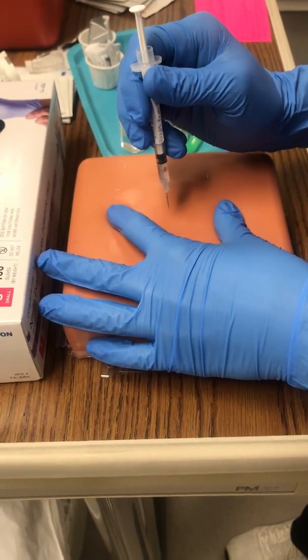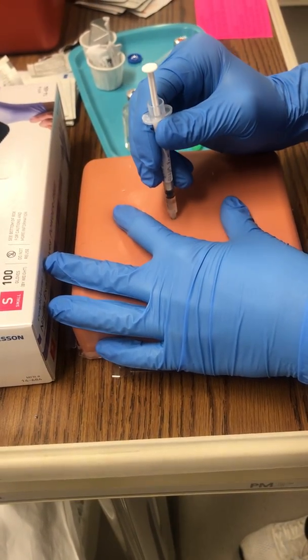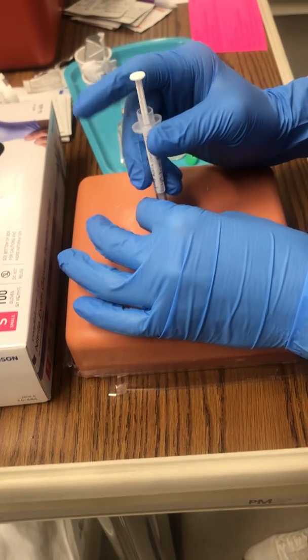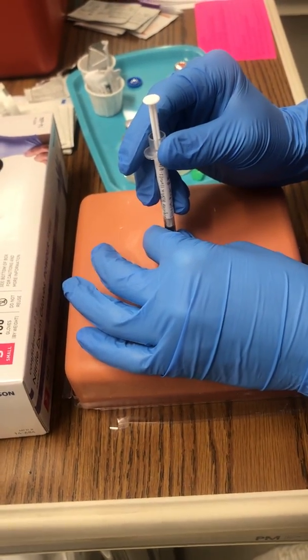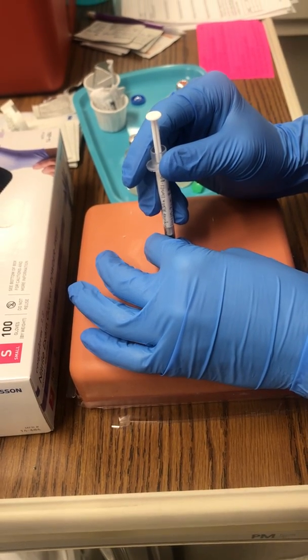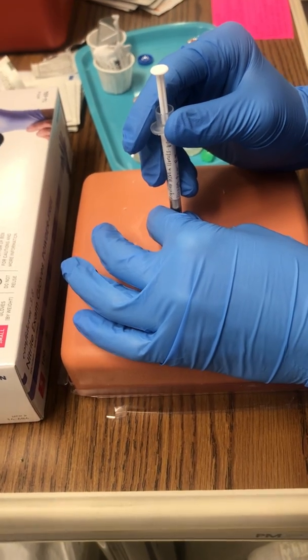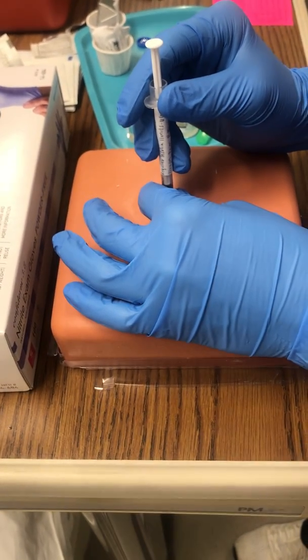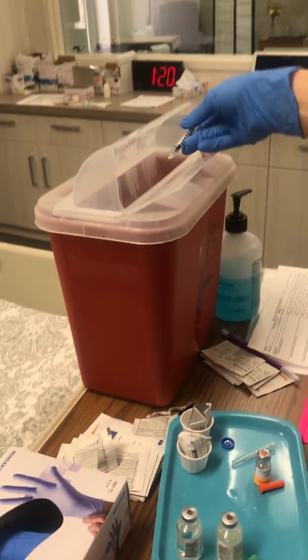So we're gonna stabilize the skin. We're gonna go in, like I said, because they have enough skin at a 90-degree angle. We're gonna stabilize, and then we're just gonna push it in slowly, and then we're gonna hold for 10 seconds. 1, 2, 3, 4, 5, 6, 7, 8, 9, 10. Then stabilize the skin, pull straight out, and then we are gonna discard it immediately.